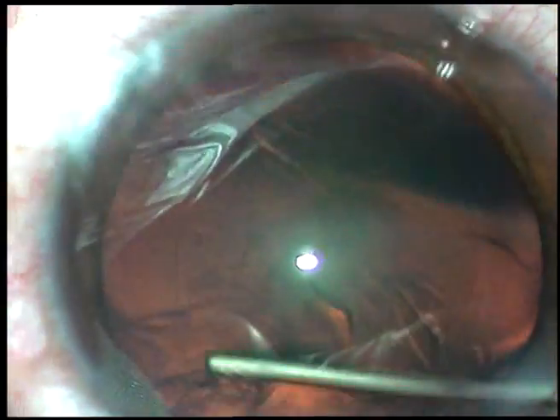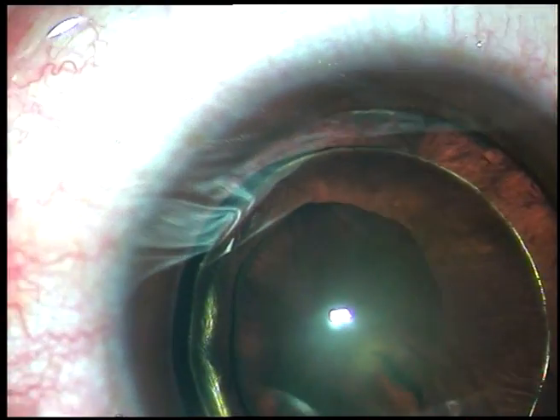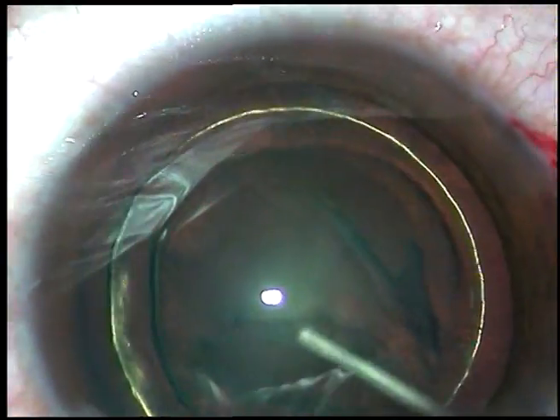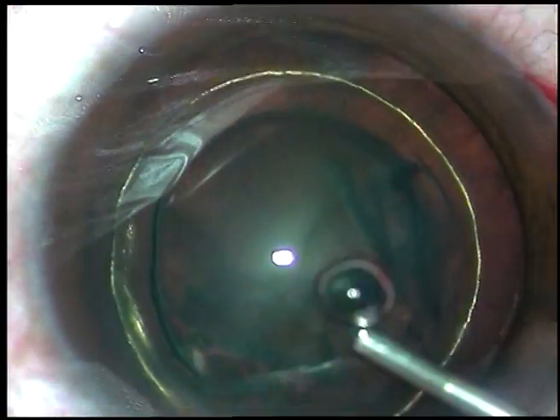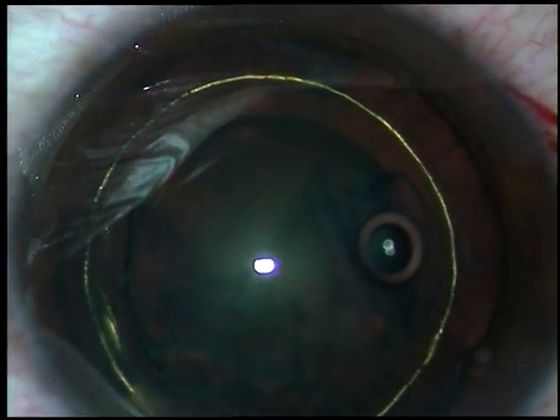Now, this is hydrodissection and this is hydrodelineation. In this case, I am going to use 450 mmHg of mercury vacuum and the probe will be kept bevel down. The lens matter will be aspirated without using any ultrasonic energy.